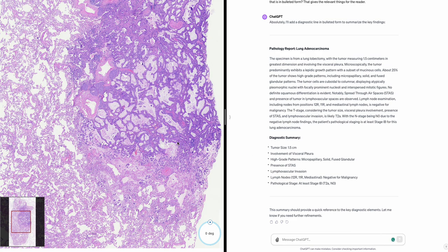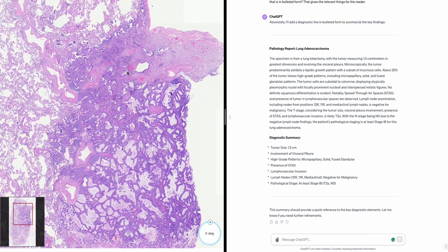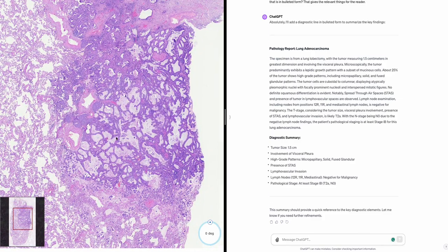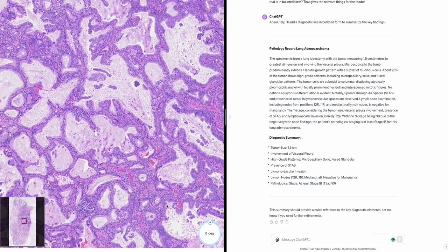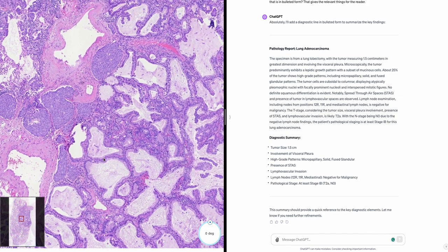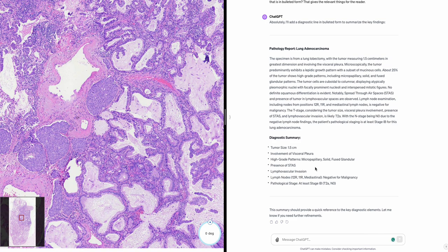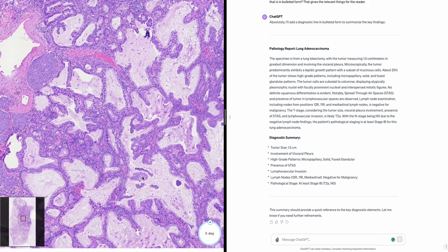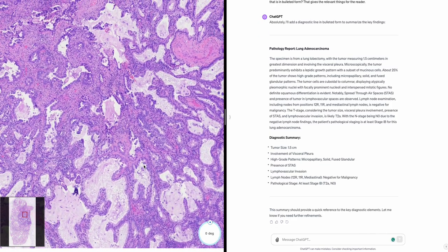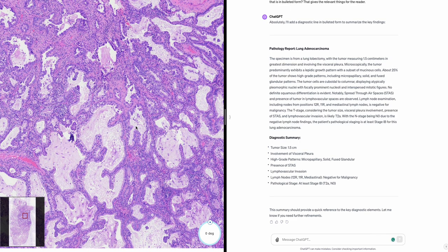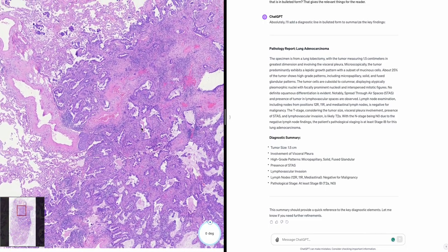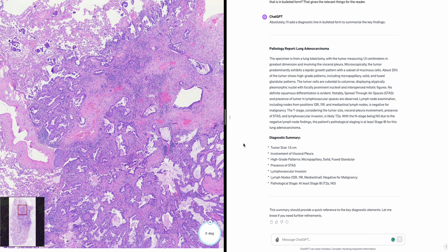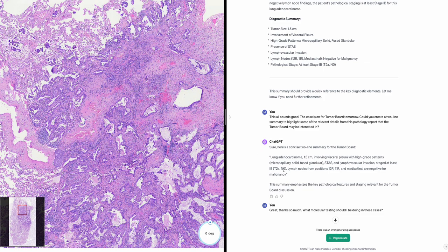The case is on for tumor board tomorrow — could you create a two-line summary highlighting relevant details? Sure. Lung adenocarcinoma, 1.5 centimeters, involving visceral pleura with high-grade patterns — micropapillary, solid, fused glandular — STAS and lymphovascular invasion; staged at least IB, T2a N0. Lymph nodes from positions 12R, 11R, and mediastinal are negative for malignancy.